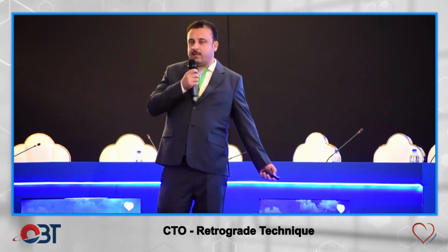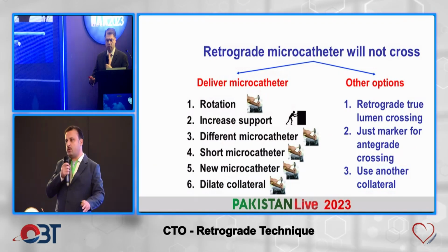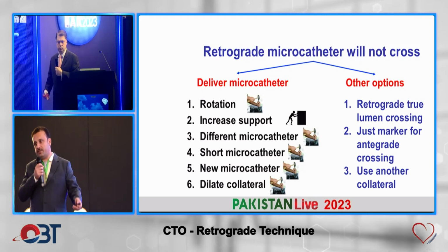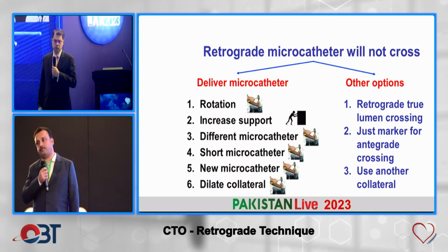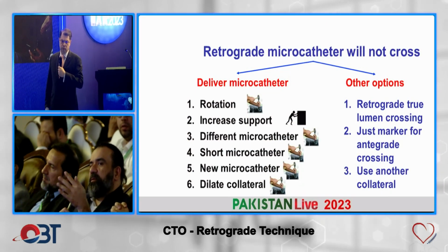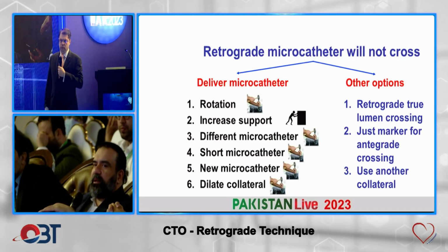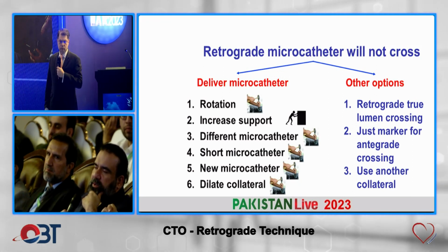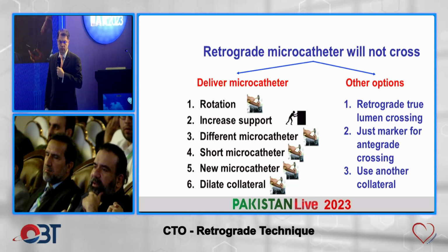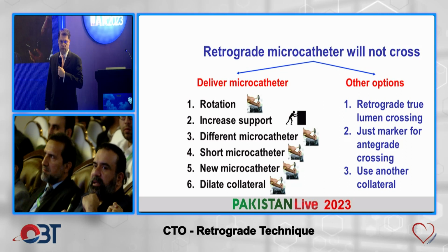Dr. Salman will tell us his experience of comparing the Corsair Pro with Turnpike in crossing the septum. I use mostly Turnpike LP. I like it because for me that's my workhorse microcatheter. So I would say that 90% of my cases I do entirely with antegrade, retrograde with Turnpike LP. And if that doesn't work, and we don't have Caravel, sometimes what I've used is actually a FineCross. So believe it or not, a FineCross may cross in that location.